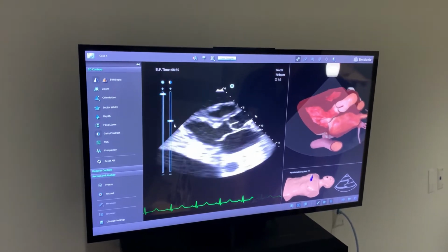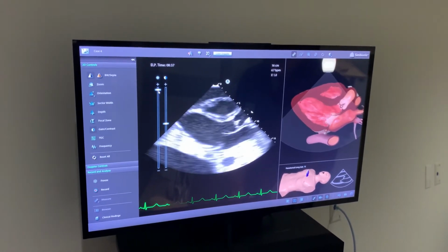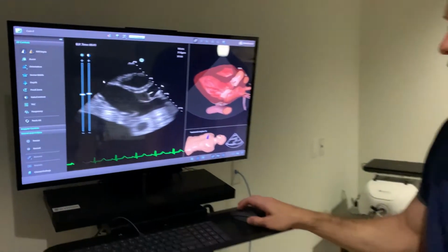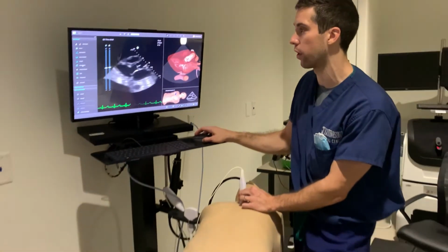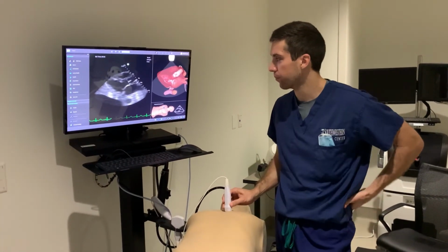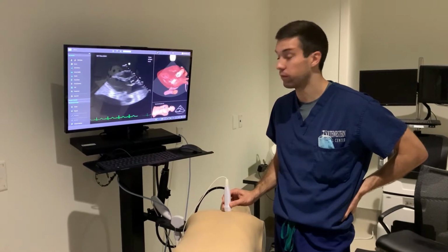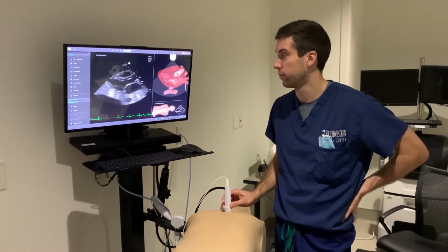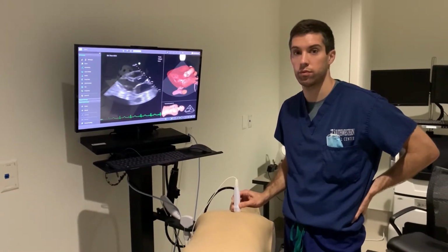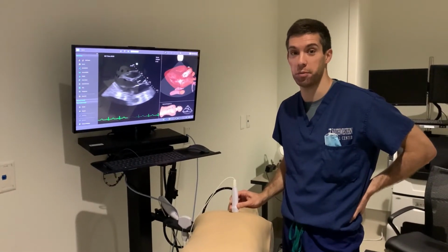Where we had it initially was probably reasonable, but just knowing that these are things that you can tweak and adjust is useful. You kind of know what's comfortable for your eyes to look at. There is a function called auto gain or optimization that most of the machines have that you can use to get optimization based on the computer algorithm. You just press the button and it makes it look a lot better.